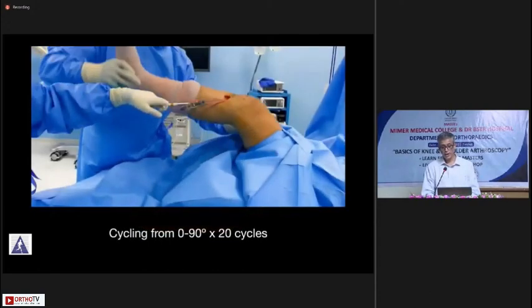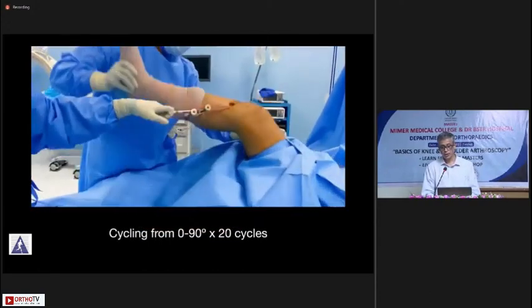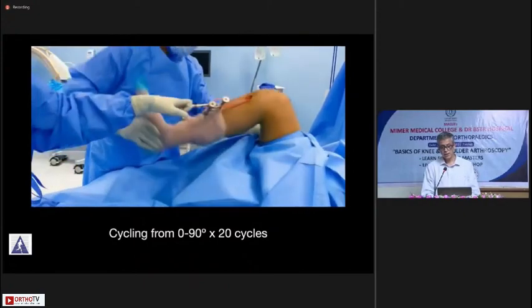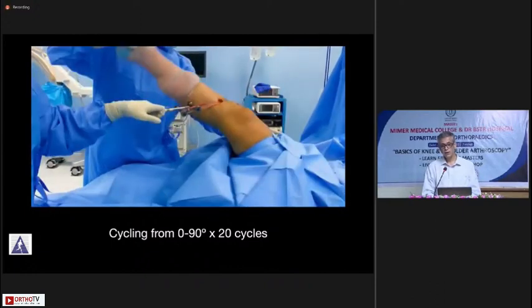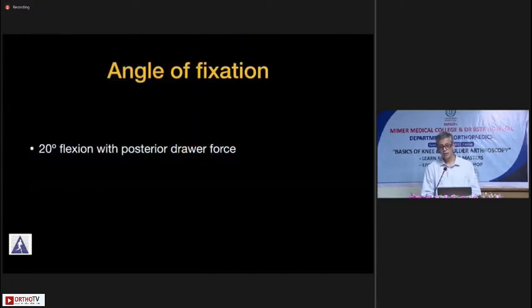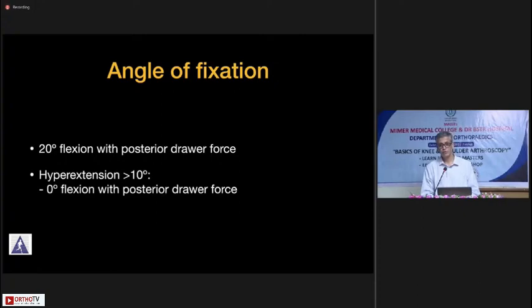After the reconstruction, I cycle the knee from zero to 90 degrees for about 20 cycles — using a tensioning device or your hands — to remove any creep from the collagen fibers. Then we fix the tibial side with an interference screw. The angle of fixation is usually about 20 degrees of flexion. However, in patients with hyperextension greater than 10 to 15 degrees, I fix it at full extension to allow less graft capture, which is very important.